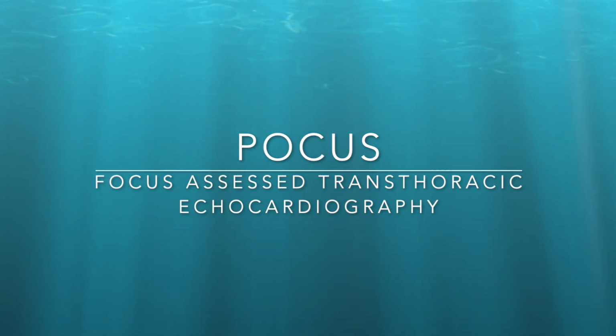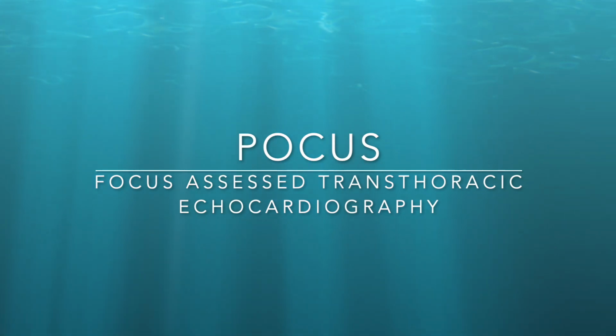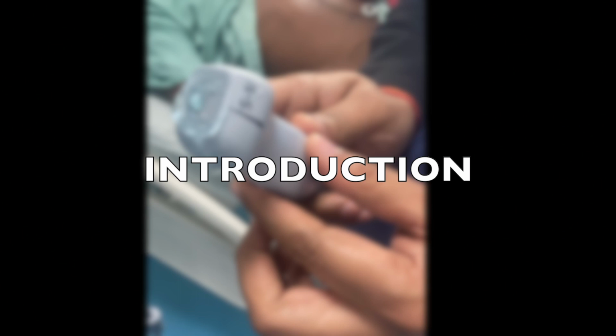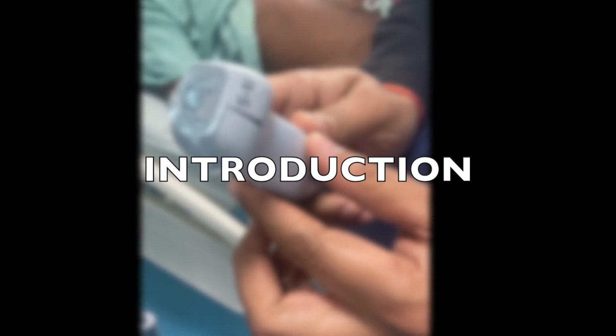Today, I am going to tell you about the FATE, Focus Assessed Transthoracic Echocardiography. FATE is bedside examination of the heart by the point of care ultrasound machine. It is usually performed by non-cardiologist personnel such as anesthesiologists, intensivists or emergency doctors.